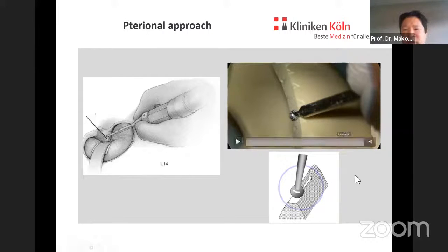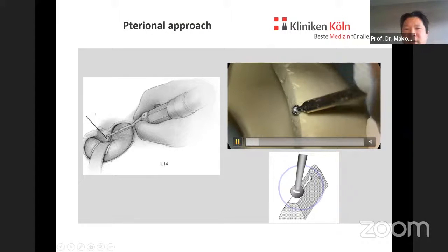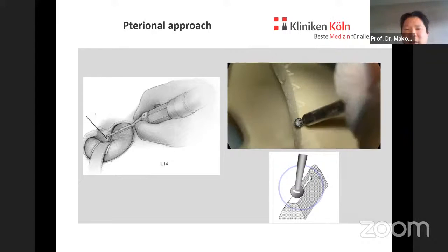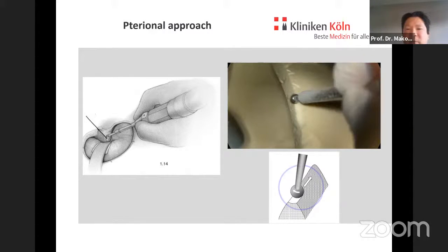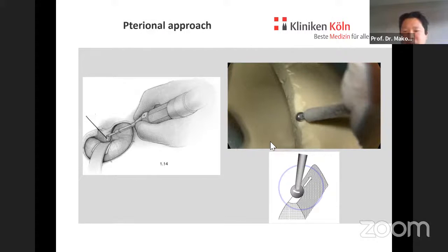Another situation is when you put the drill more from upwards, so perpendicular onto the edge. It's a little bit more difficult, but the drill is drilling clockwise. So when you want to do vertical dissection, vertical drilling, this is also a situation which you can handle much better than in other situations. So you're leading the drill upwards and vertically, but you're coming from a steeper angle.